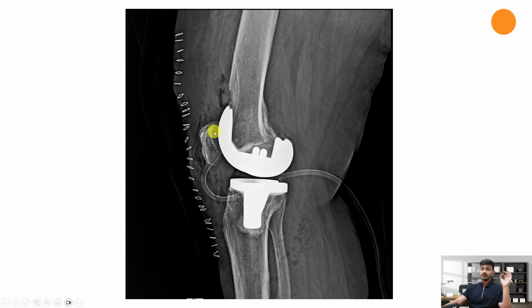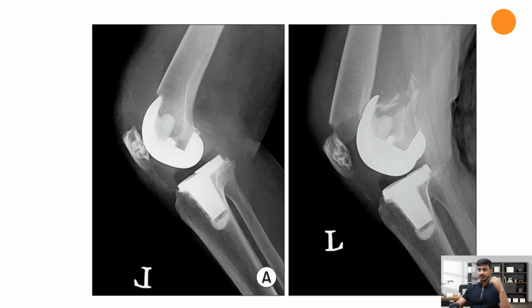So what happens when we notch, especially with grade 3 and 4, which are really dangerous? Sometimes what happens is if the patient even has a trivial fall and there's not an adequate time post TKR between protecting mobilization and letting them mobilize freely, sometimes a supracondylar fracture of the femur can occur as a dreaded complication. So as far as possible, let us avoid notching while doing a TKR.